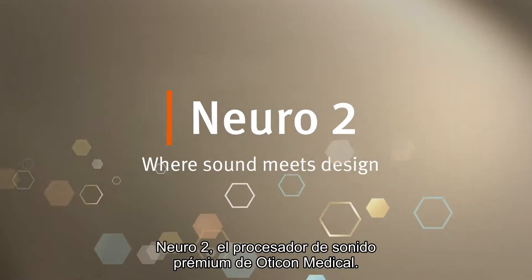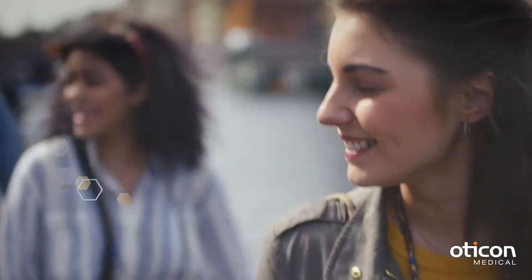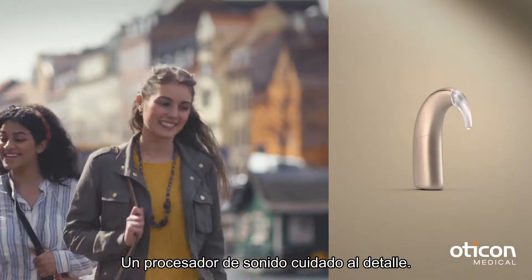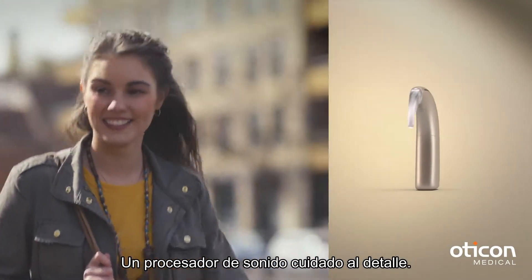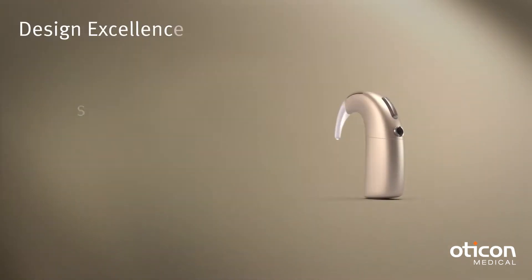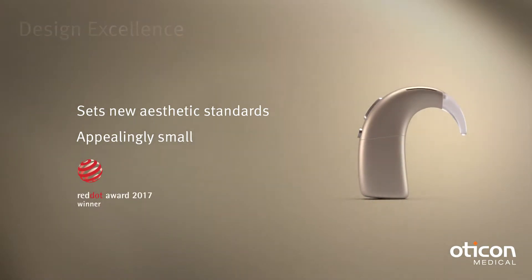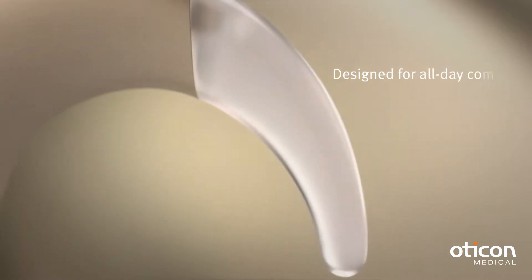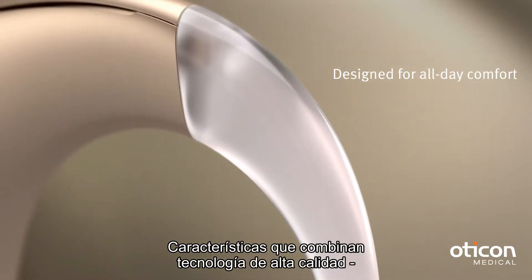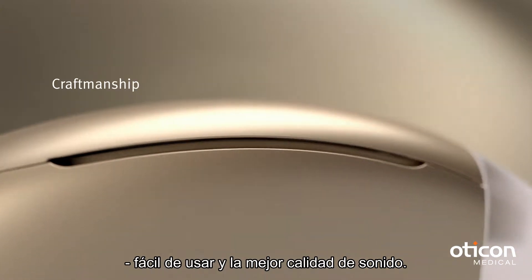Neuro 2, the premium sound processor from Oticon Medical. A sound processor characterized by attention to detail, with carefully crafted features that combine high-quality engineering with high levels of sound quality and usability.